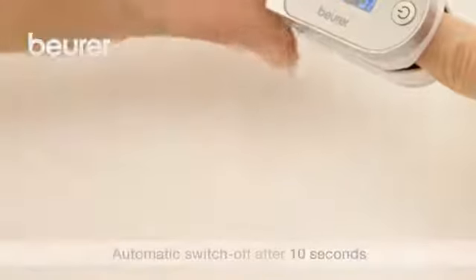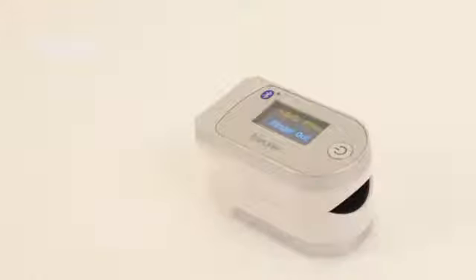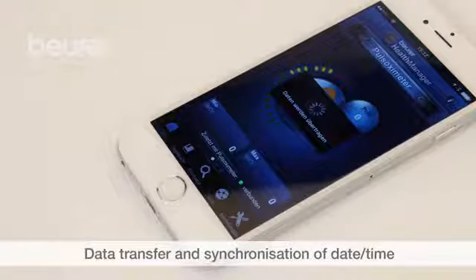The device switches off automatically around 10 seconds after you've taken your finger out. If the PO60 is switched off, you can press and hold the function button to transfer the data to the app.